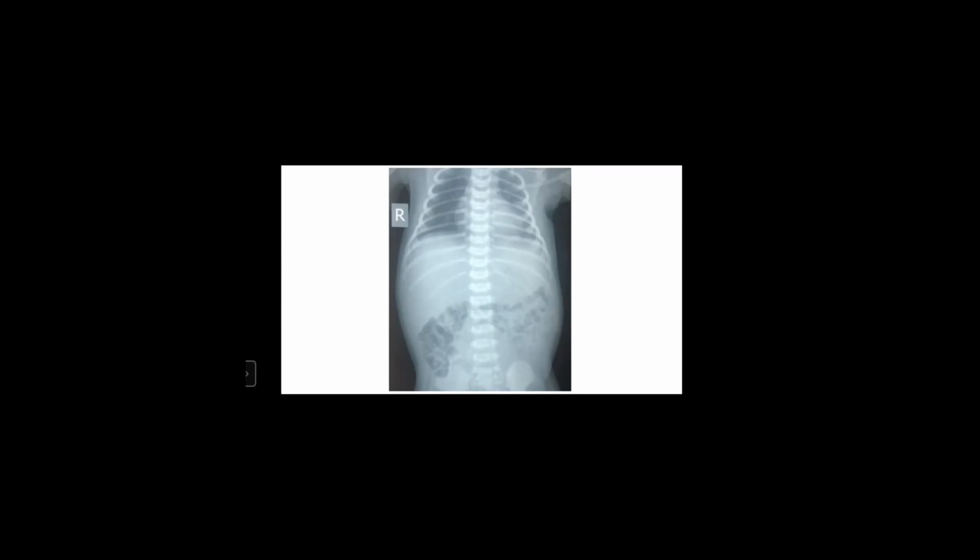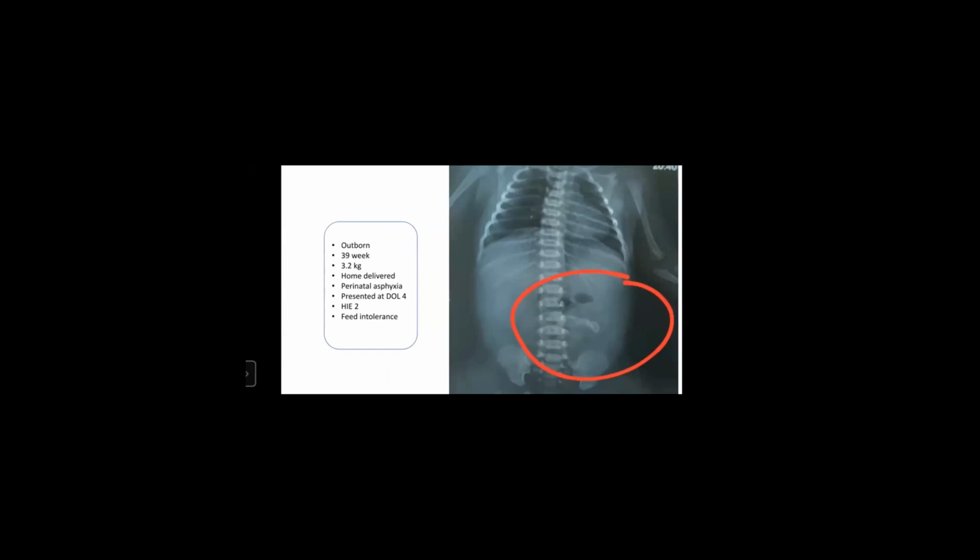But in this case, if we see clearly the first X-ray, Ankit, the first X-ray. Yeah. In the distal third, we can actually see a tie. There's a knot, which is due to the thread itself. So it was nothing but, as Garima said, the umbilical cord only. Though it's not supposed to be radiopaque, maybe due to some calcification, or due to its dryness, we don't know, but it was the umbilical cord only.